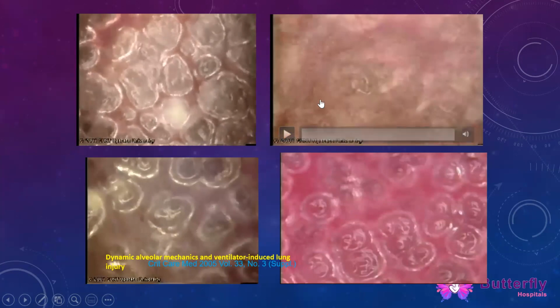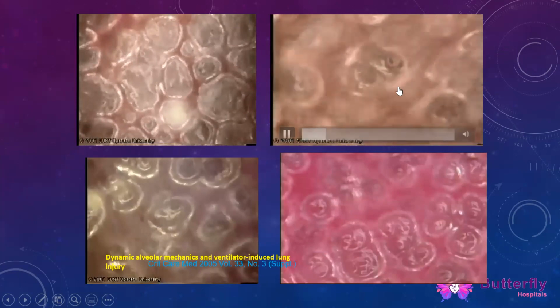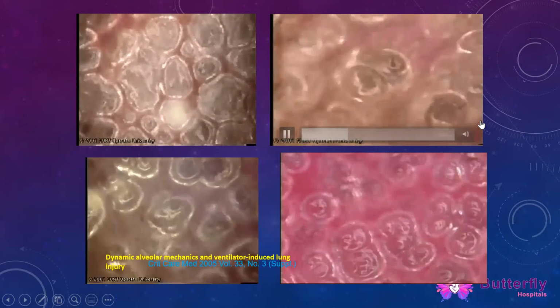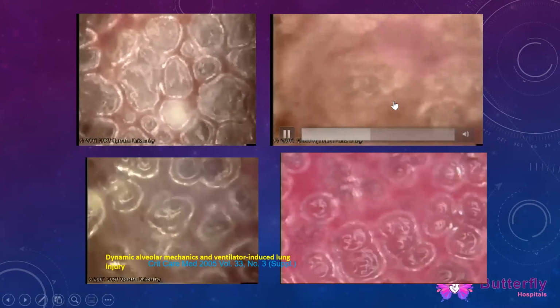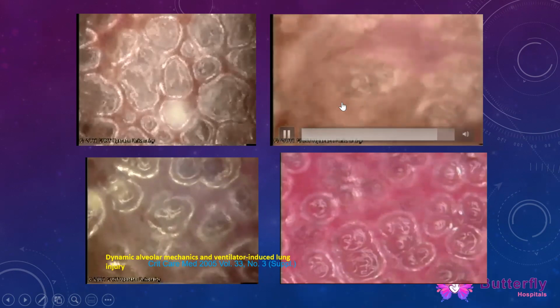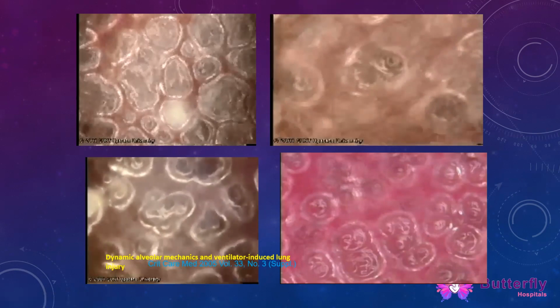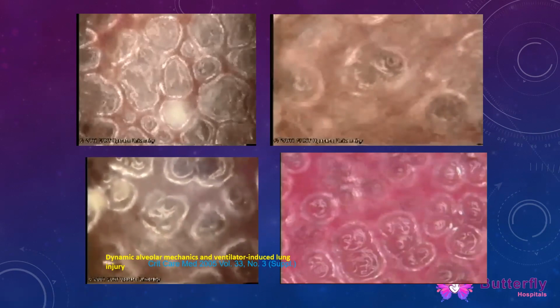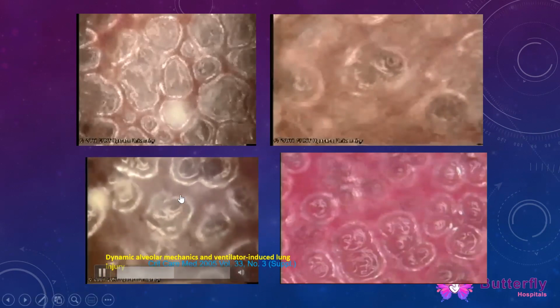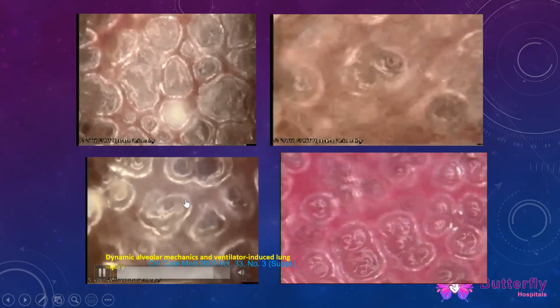So these are the babies with RDS. In this picture, you can see conventional mechanical ventilation without giving much positive end expiratory pressure. Every time, the lungs have to open up completely and then completely collapse. This is the picture of initial RDS when you don't give CPAP or surfactant. When you give some PEEP and surfactant, this is what happens. They try to open up, and it prevents the collapse, but you can see there's some overstretching happening.